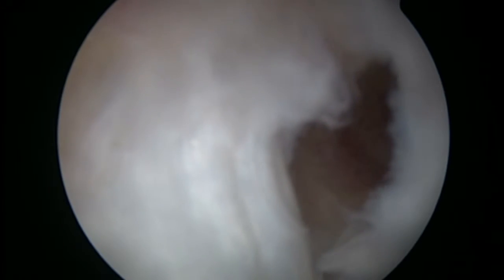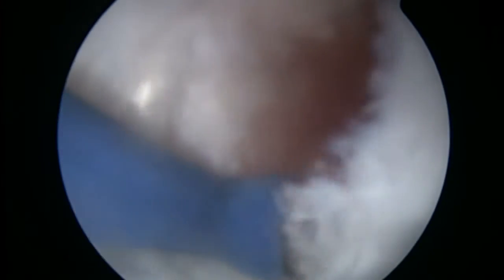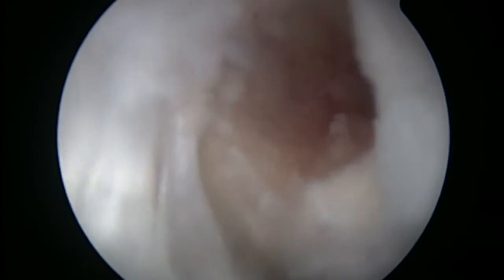After a bit more cleaning on the femoral side, you can see the femoral hole where the graft is going to sit. It is nice and clean — we are taking off any rough edges so there is nothing rough rubbing over the graft once it passes into the hole. This is a small procedure, taking about one and a half to two hours.